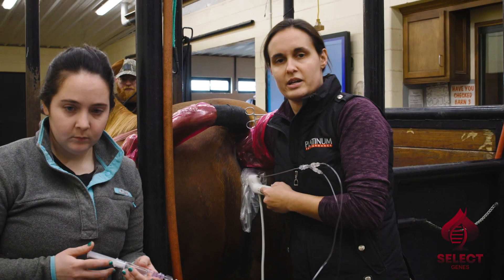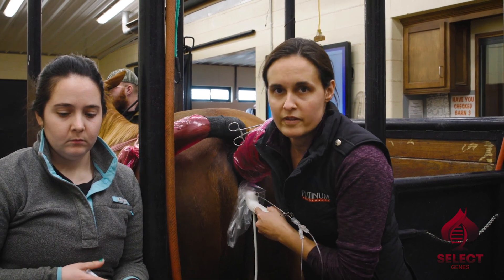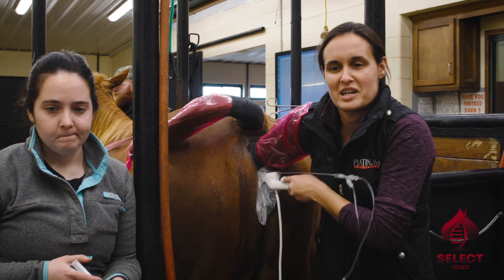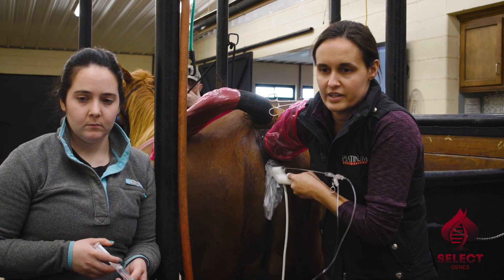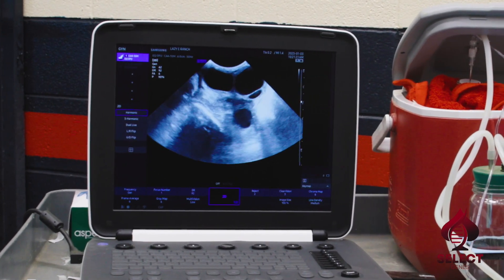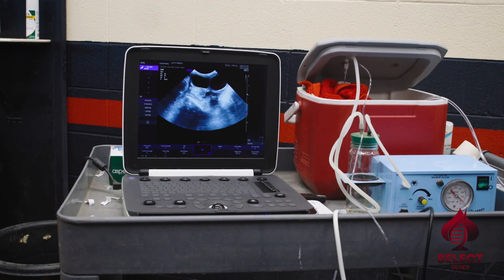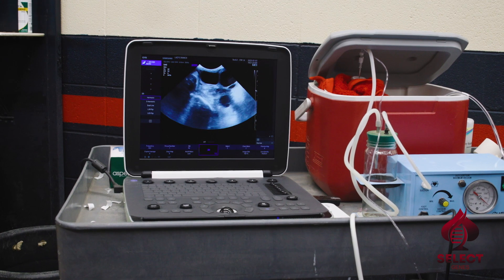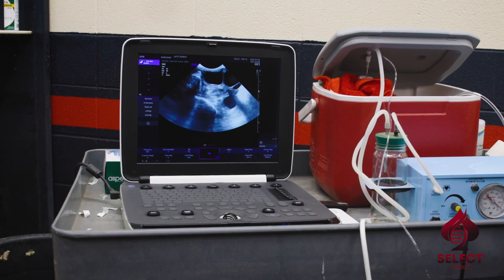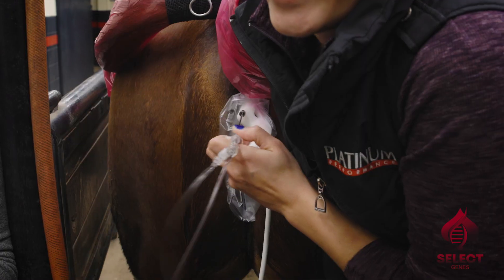We're going to go in and I'm going to find her ovary internally. I'm going to move everything important out of the way and bring it back to my ultrasound here. This is an ovary and those black circles are actually her follicles. The follicle is the egg or oocyte's home. You can't actually see the egg or the oocyte on the ultrasound or by the naked eye — it's microscopic, it's just one cell.